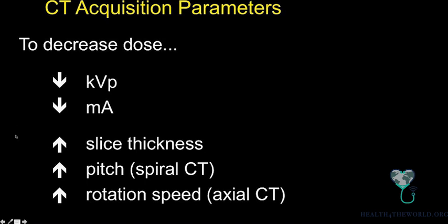Dialing down the number is easy. You just enter it into your scanner settings. The hard part is the initiative and the intimidation of, oh man, I don't want to break something and maybe I'll mess up the numbers for the next patient. So just take it slow, drop the numbers. I'll show you some example numbers that we use for our kids.